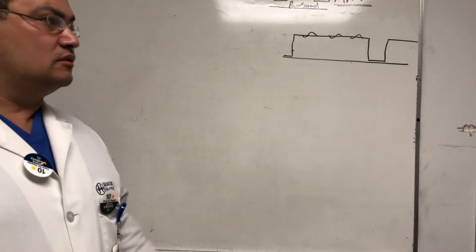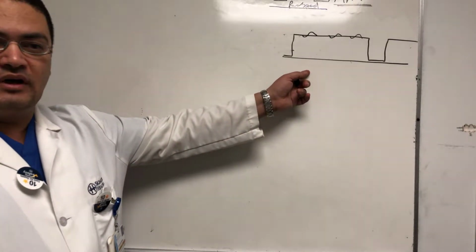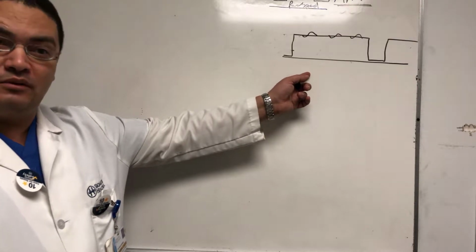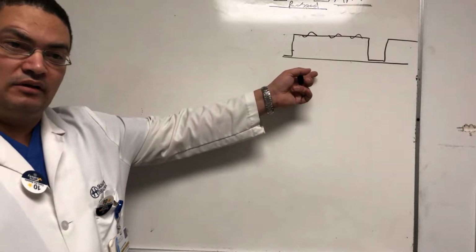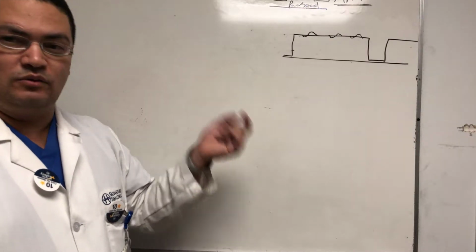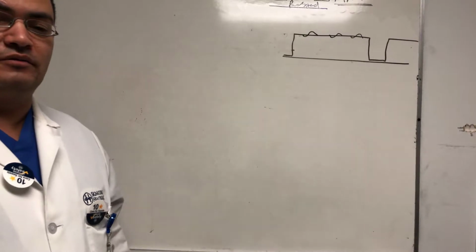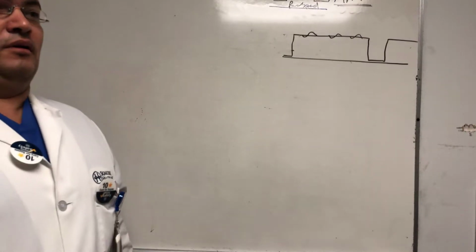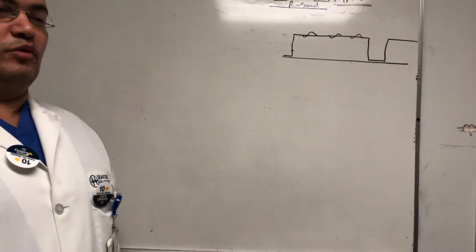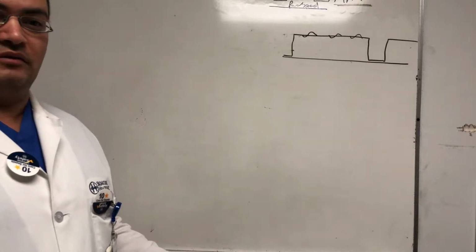And believe it or not, this actually makes the patient even more comfortable. Because if you think about it, the patient doesn't know what your plan is, doesn't know what the mode is. What he knows, what he notices, is that there is a huge amount of CPAP or PEEP, like this, and he can breathe normally and comfortably on top of that.